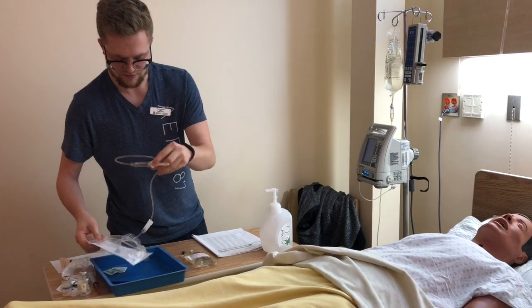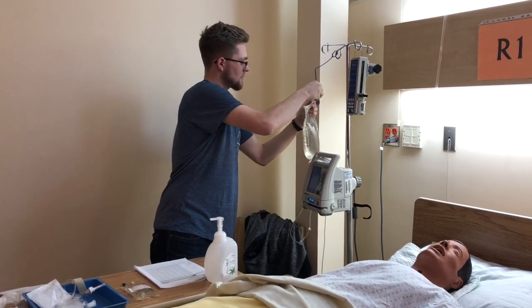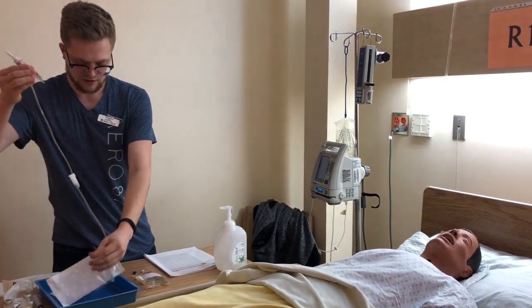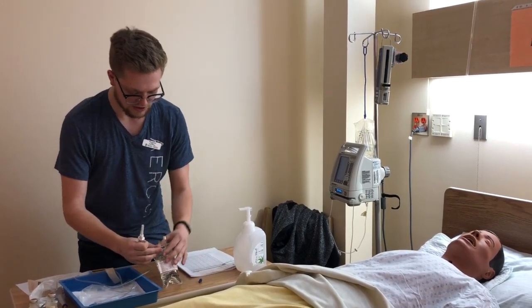And before we do that, I'm going to choose to just take this down a little bit. So this up like so. Good. All right, so we're going to be inserting this. So we know that these are both going to be sterile, so when I take these off, we want to not be touching them at all.